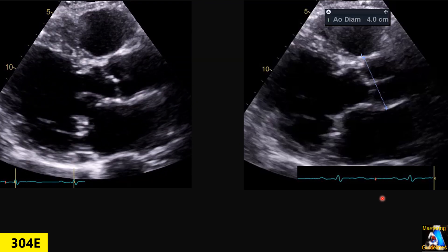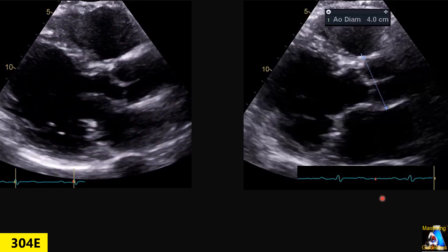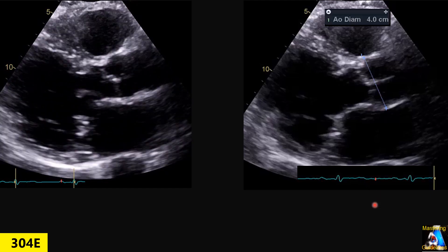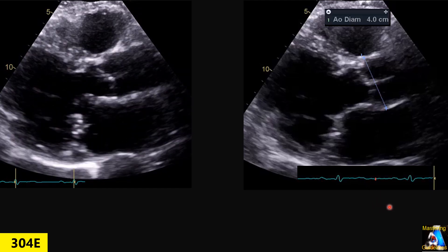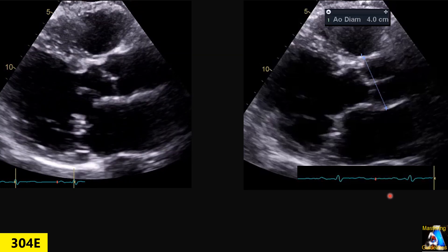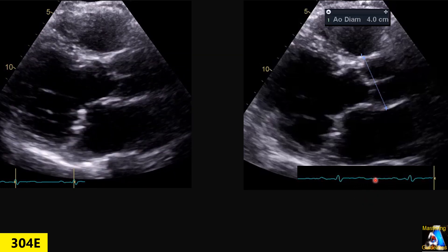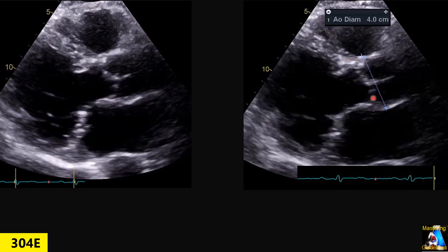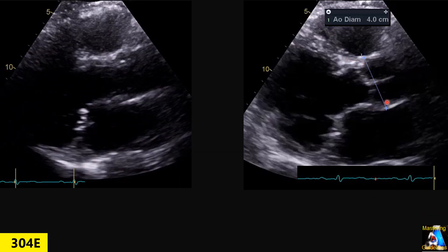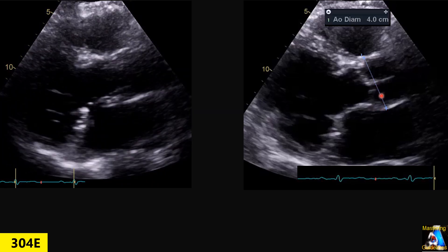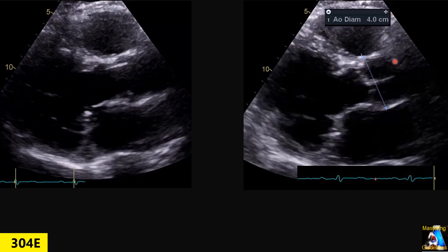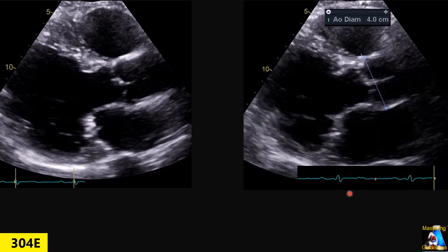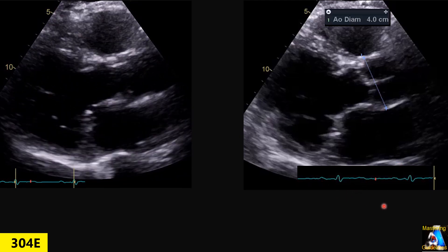Some cardiologists — especially surgeons — prefer to measure at the peak of systole. In those cases, for follow-up purposes, the best approach is to measure at exactly the same time point as the previous study so they can track changes. However, you should also add the classic correct timing measurement. So measure twice and mention both on your report.